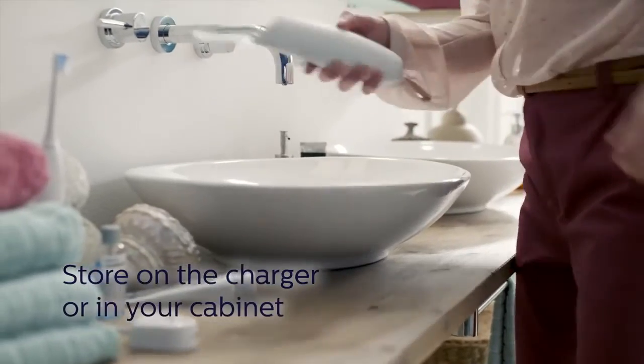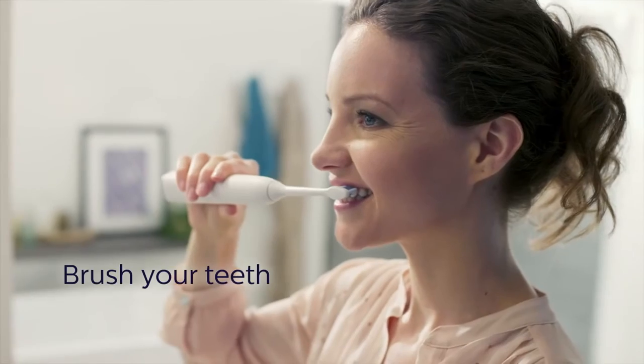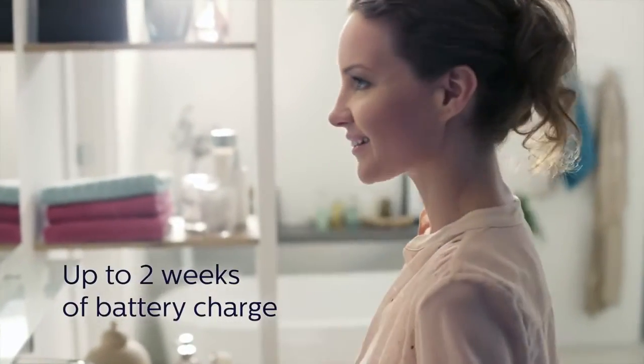Store on the charger or in your cabinet after each use. Then, brush your teeth. When fully charged, its battery lasts up to two weeks.